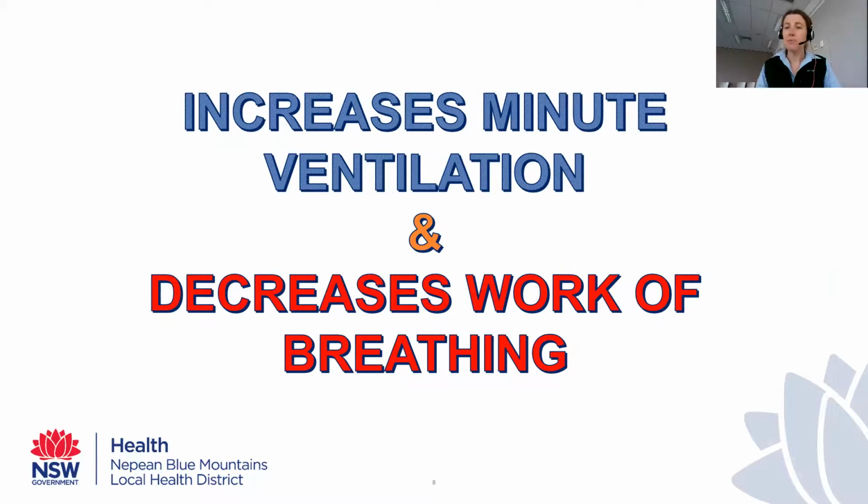We add in this inspiratory pressure because ultimately it increases minute ventilation. So our minute ventilation is our tidal volume, so the amount in mils we take in a breath, times our respiratory rate per minute. We're going to increase that tidal volume, so we're going to increase the amount of mils that patient takes per breath, and ultimately that's going to increase our minute ventilation.